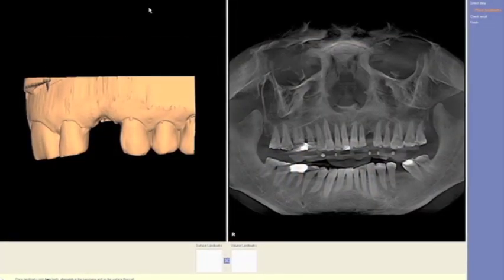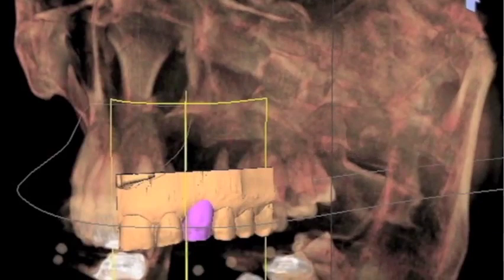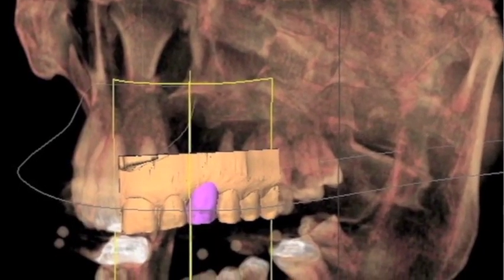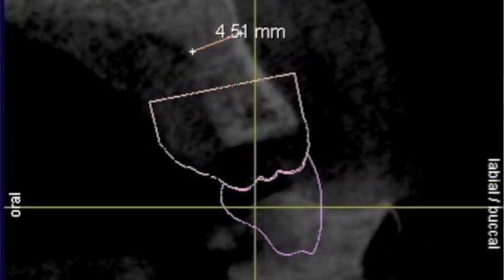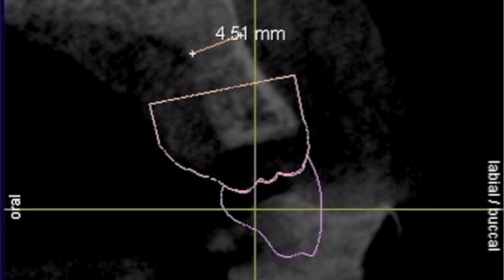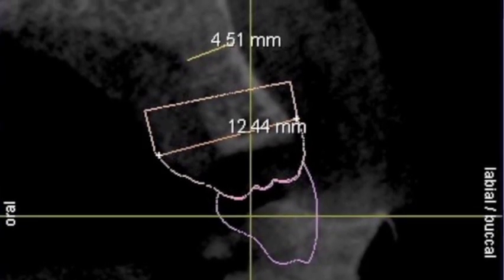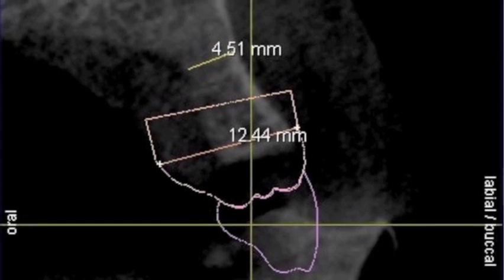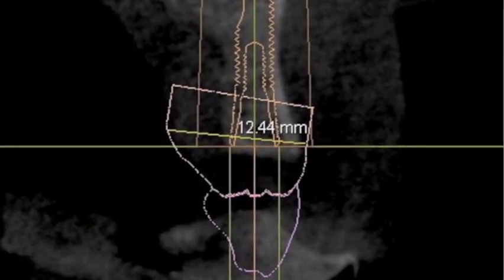Here we see the CEREC plan. The CEREC plan allows us to capture surface data and superimpose that on the Galileos scan. This allows us to truly virtually plan the case without ever having to do a diagnostic wax-up. Here you can see a 4.5 millimeter width ridge, and here's the surface data which shows a 12 millimeter ridge — quite a discrepancy. Without Galileos, this surgeon probably would have been in trouble.